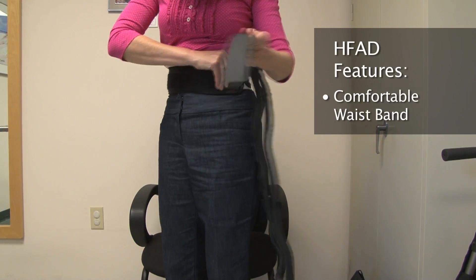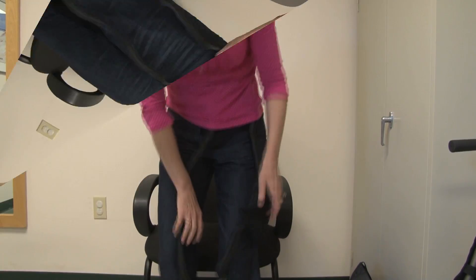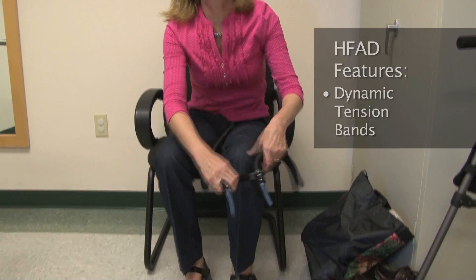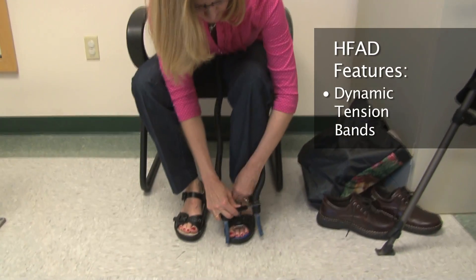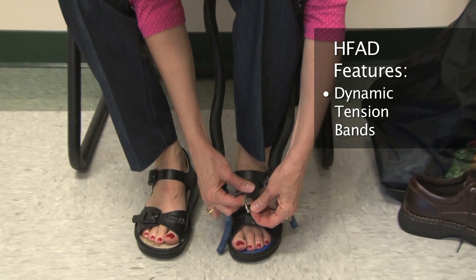The HFAD consists of a comfortable neoprene waistband with a Velcro closure that makes donning quick and convenient. The waistband connects to dynamic tension bands that are housed within durable mesh sleeves that attach to shoelaces or the strap of a sandal with use of a quick-release closure.